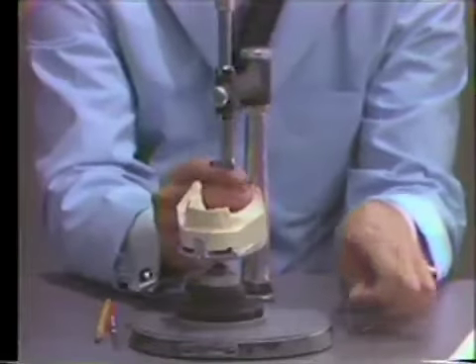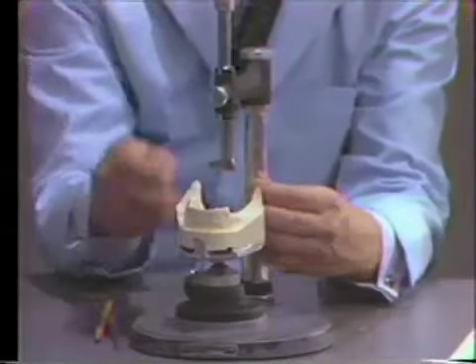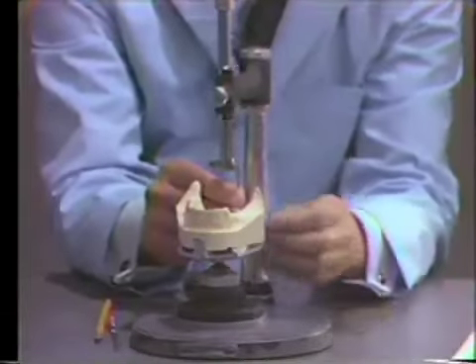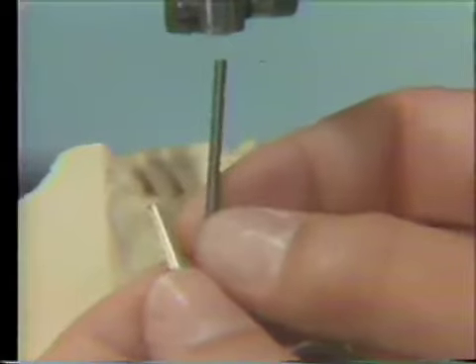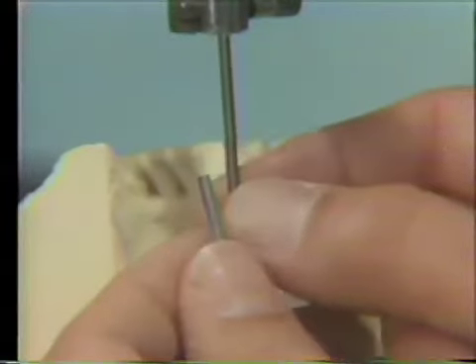Now the carbon is merely a cylindrical or parallel piece of carbon which can be inserted in the surveyor. Now this carbon is very fragile and will break if we tighten the screw as we insert it into the surveyor.